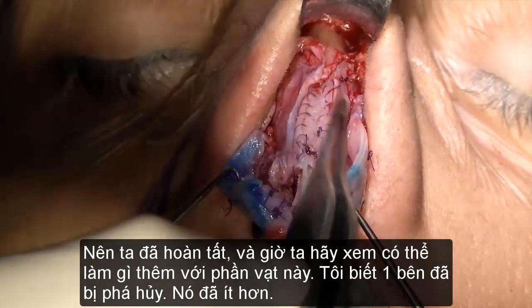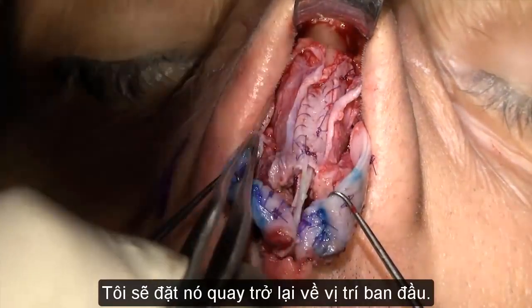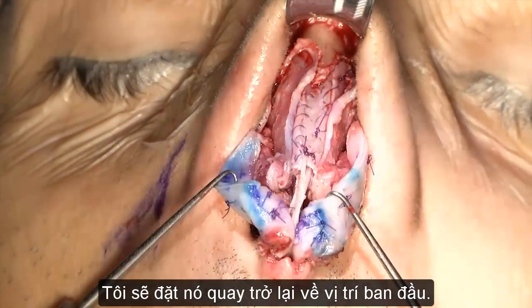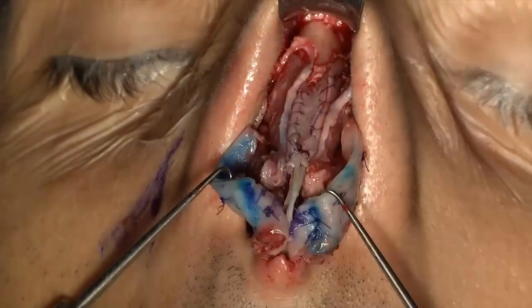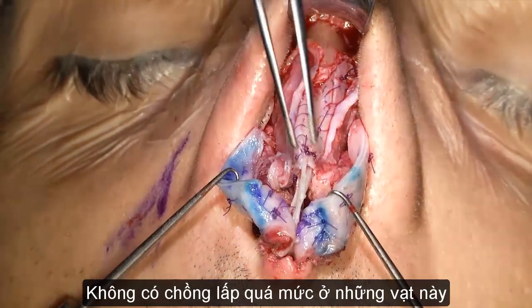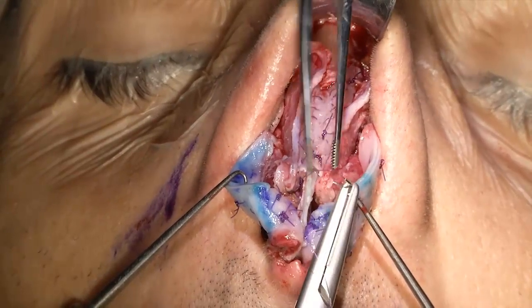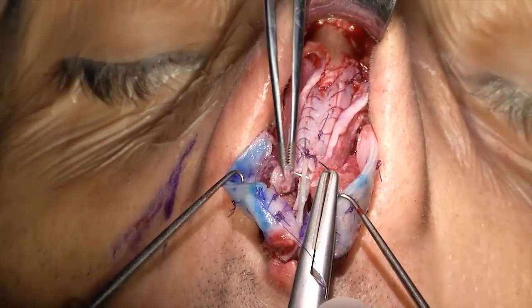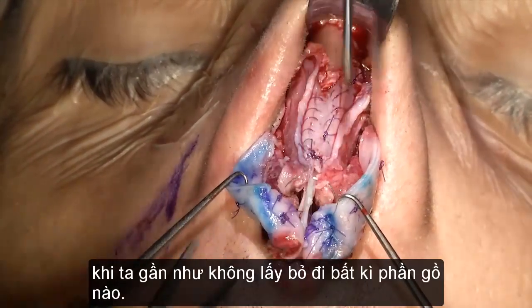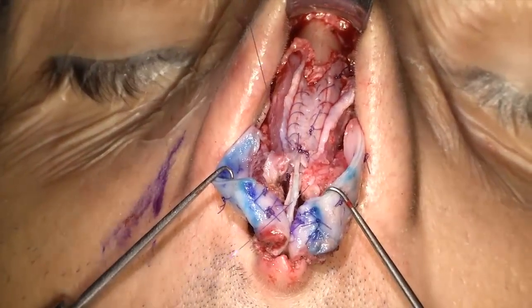I know one has been damaged, the other less so. And I will just put them back to their original position. There's not much of an overlap in these flaps, since we did not take down any hump. Actually, we didn't take down any hump.